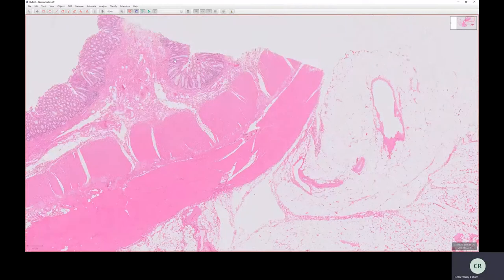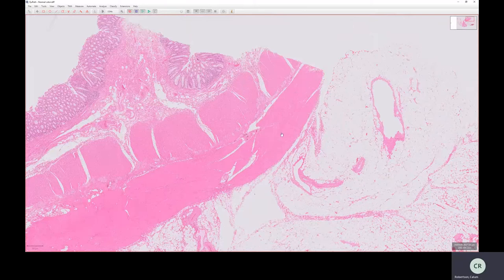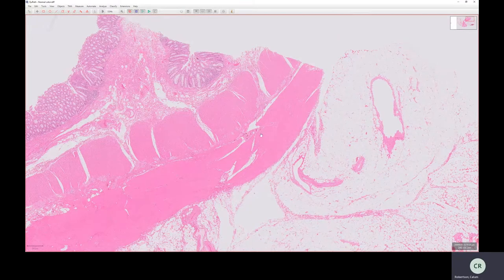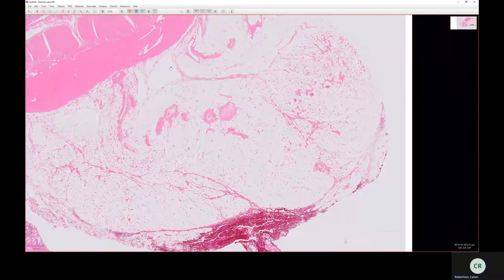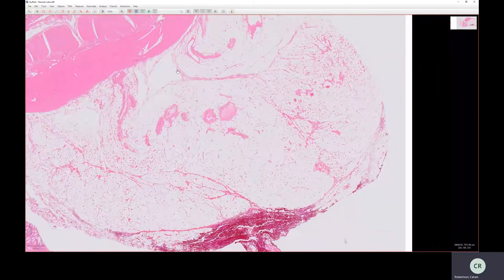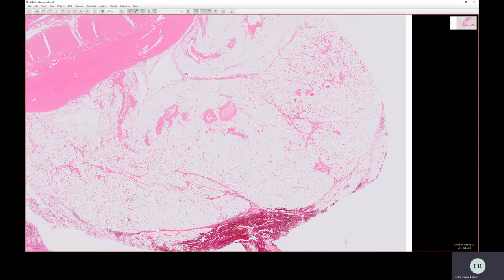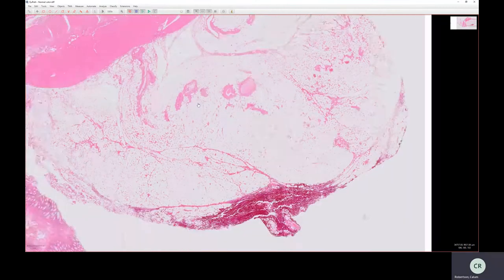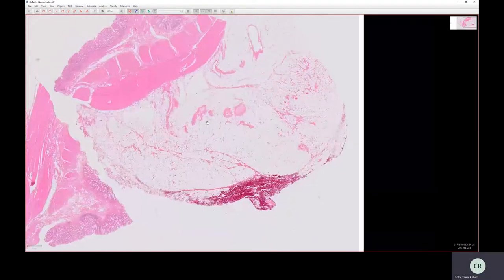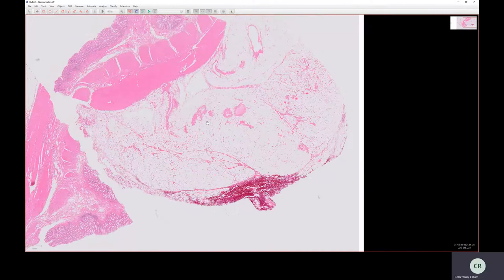So that's the mucosa, the submucosa, the muscularis propria. And underlying that, or external to that, or on the antiluminal side, is a layer here composed mostly of fat with some blood vessels in it. And this has got a different name depending where you are.